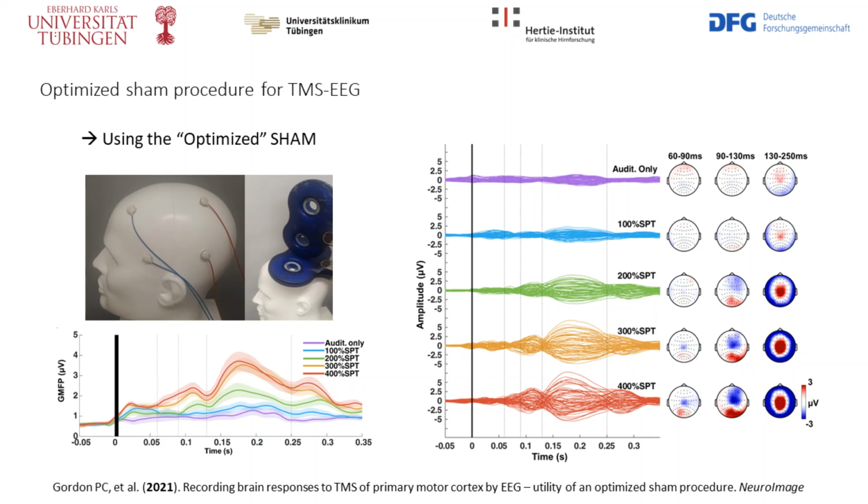It follows that even if the peripherally evoked responses in both sham and real are of large amplitude, whichever difference found between these two conditions will only be explainable by the direct cortical activation by the real TMS.